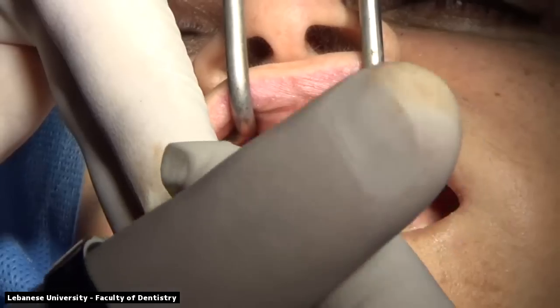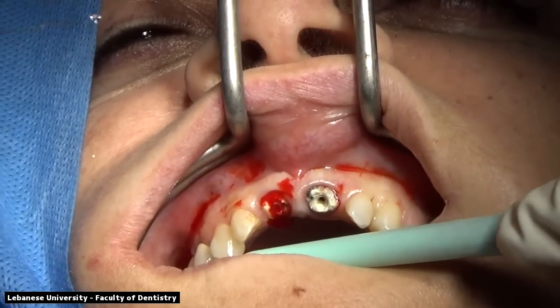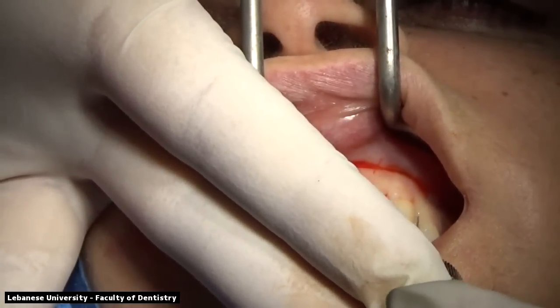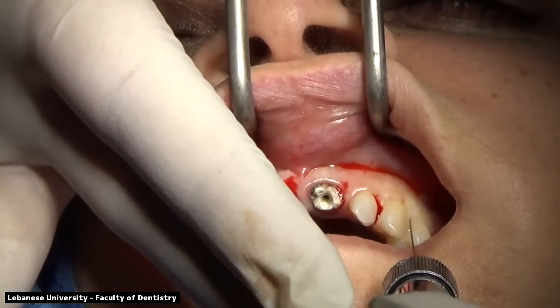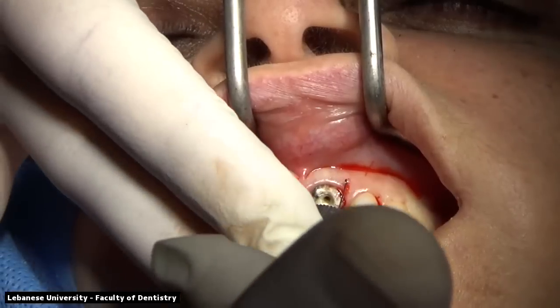We are currently doing the anesthesia, which will be a local anesthesia that is placed all the way from the first premolar on the right side to the first premolar on the left side. The patient has the temporaries already prepared, and the case is prepared for restoration after we're done.